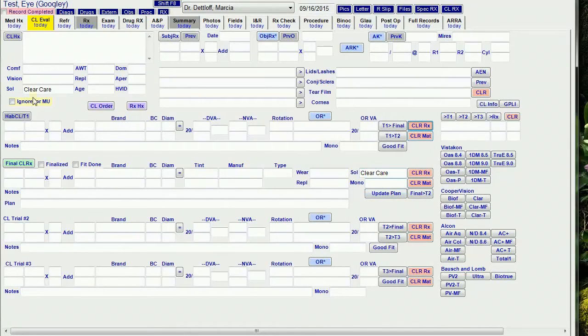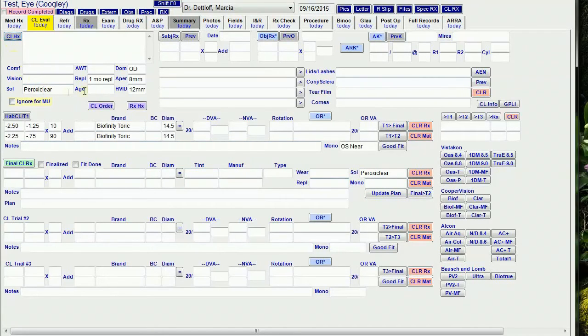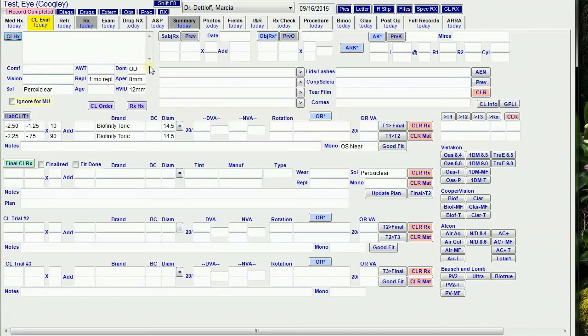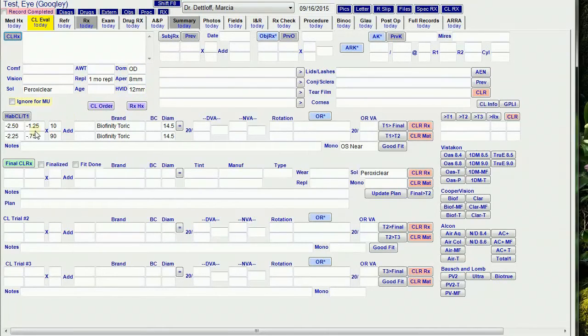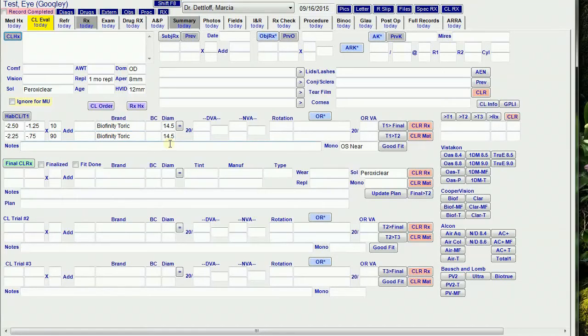If it's a former patient, I usually click the contact lens history button. That gets the solution and the replacement from the last RX. It puts the previous dominance, aperture, HVID values into the history fields. And it runs the habitual T1 button that pulls forward the previous contact lens RX into the habitual fields.